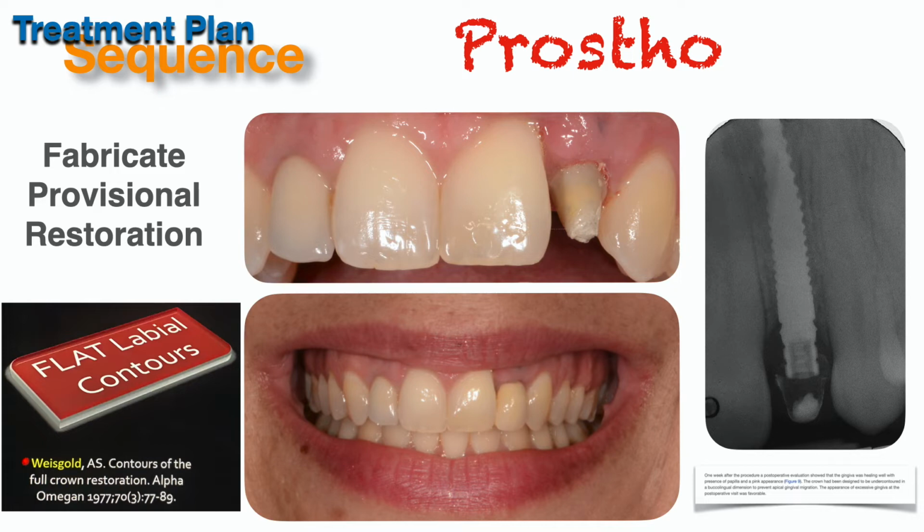So this is her provisional. It's going to be under contoured. I want enough soft tissue to sculpt and work with. So there are two concepts. Do I want to preserve if everything is perfect, or it wasn't perfect, so I'm going to have to sculpt it and regenerate it. But we run into issues because we have teeth and we have multiple surgeries, and during this provisional phase, we really want to evaluate the vitality and health of the adjacent teeth, because we're working in a narrow spectrum here.